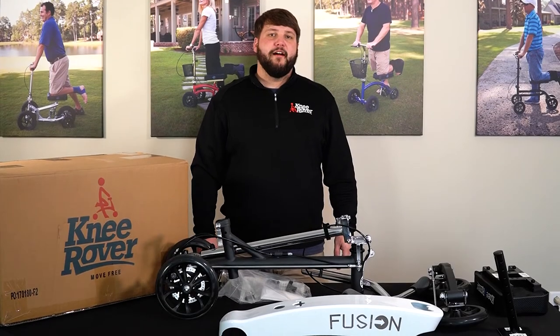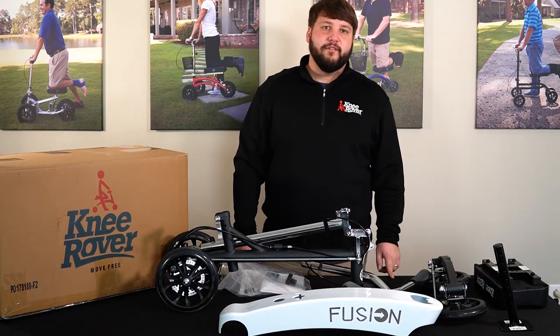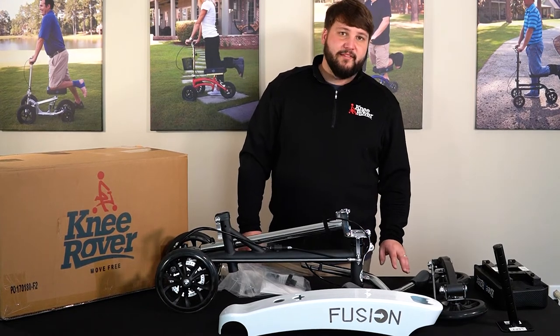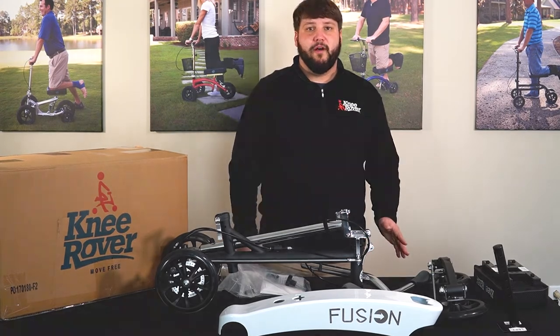Hey, Justin here from kneerover.com and today I'm going to show you how to assemble your knee rover fusion. This will be the same assembly for your knee rover fusion, your knee rover hybrid, or your knee rover all-terrain model.